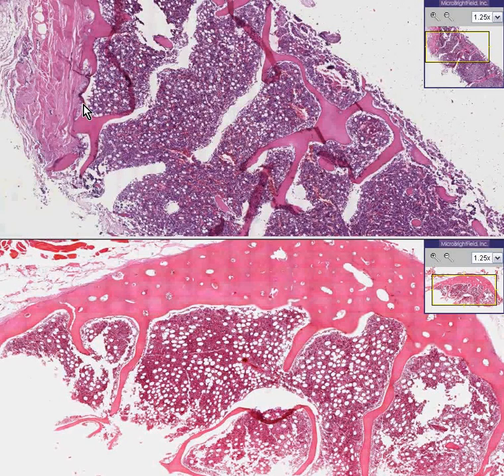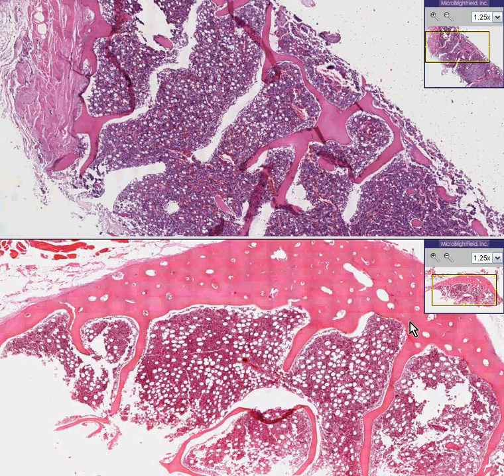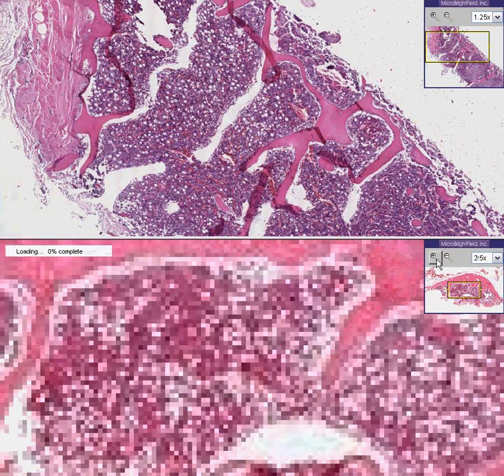This will be a quick, easy, and logical demonstration. Here at the bottom is a normal bone and a normal bone marrow. Here's the bone, here are the trabeculae or spicules, and here is the bone marrow in between.